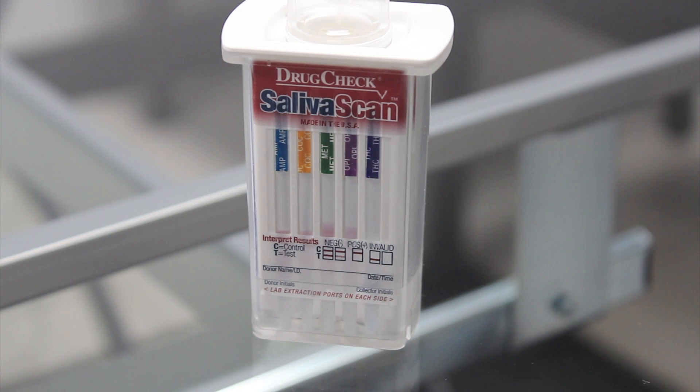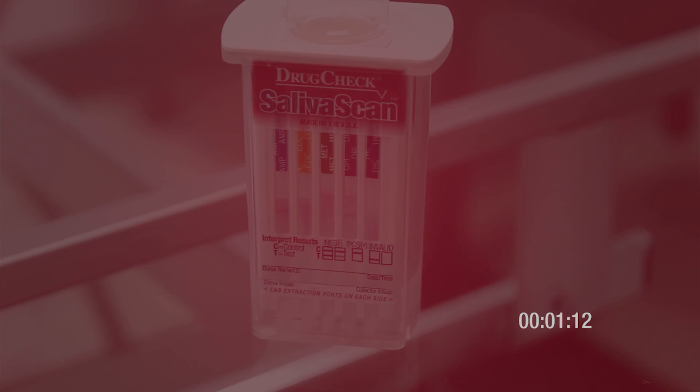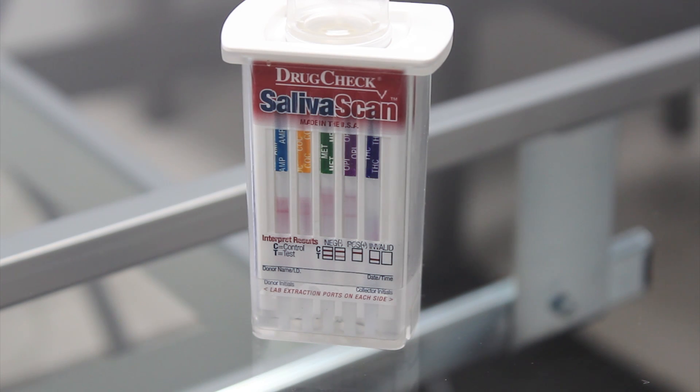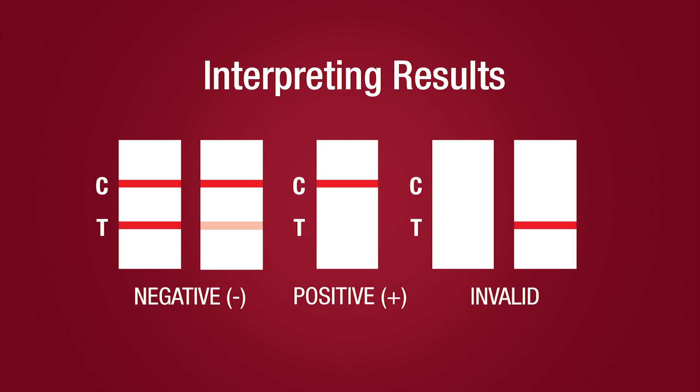Set the device upright on a flat surface and keep upright while the test is running. Wait for colored bands to appear in test results area. Allow the test to proceed undisturbed until a reddish-purple CTRL-C line appears and the test background clears. The CTRL line is the uppermost line in the test channel.